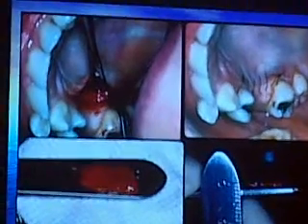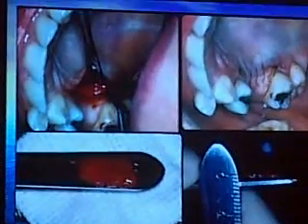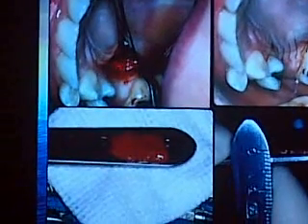Underneath here is some connective tissue. And you can see it's showing right there. Okay, so we go to the palate, it's the same case. This is our donor here, this is the tissue taken, and that shows just how much is the thickness.